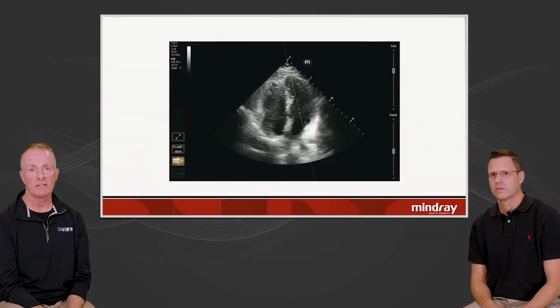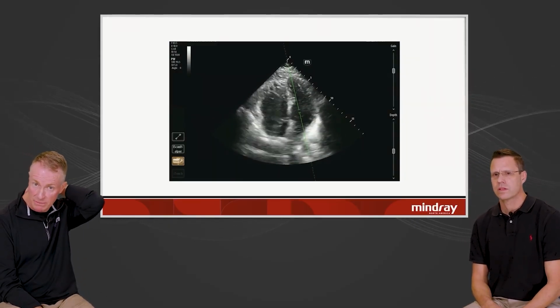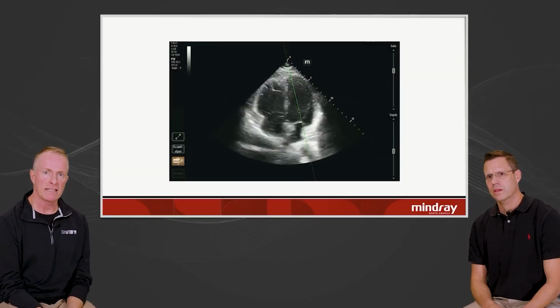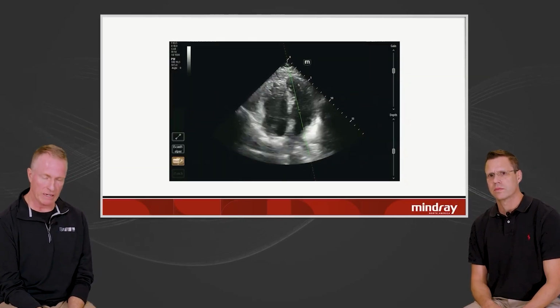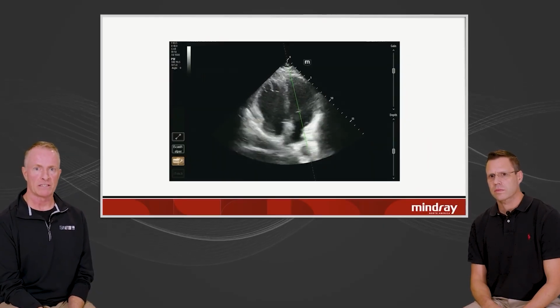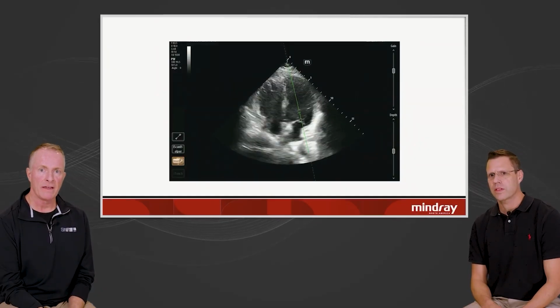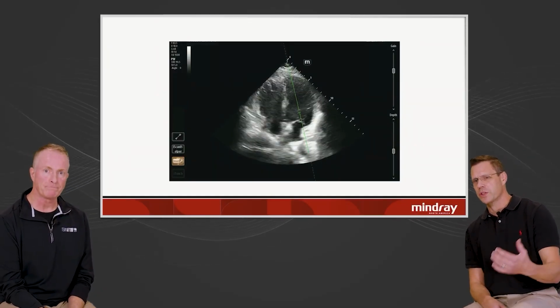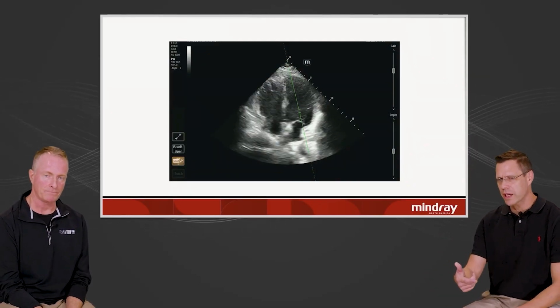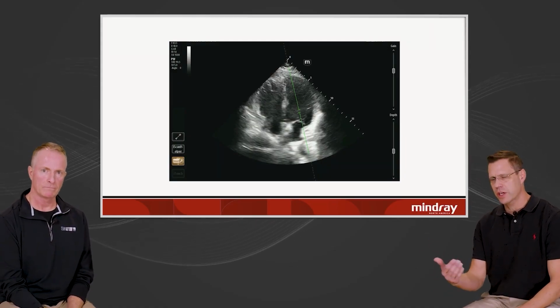Okay, the way to measure diastolic dysfunction, the easiest way, and this is pretty simple, is to just put the pulse wave Doppler gate just inside the ventricle, just inside the mitral valve. You don't want to see the valve leaflets, but just inside that area, like this. And then I think one of the most difficult things when doing diastology is actually the knobology, right? So you're going to drop a pulse wave gate in the mitral valve inflow, and then you're going to get your inflow velocity, your E and your A, and we'll show all that in a little bit.